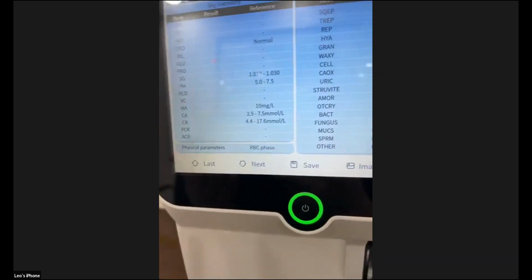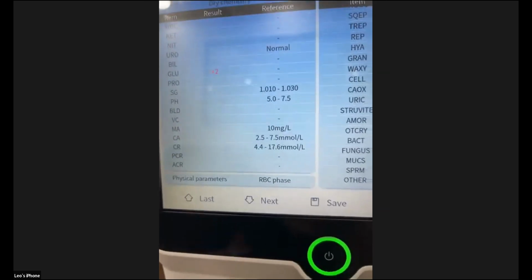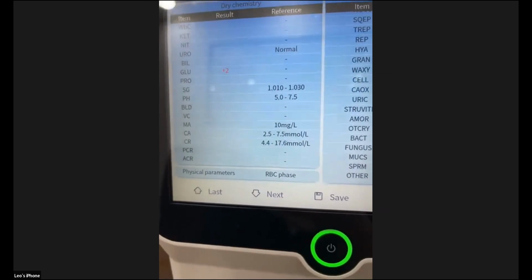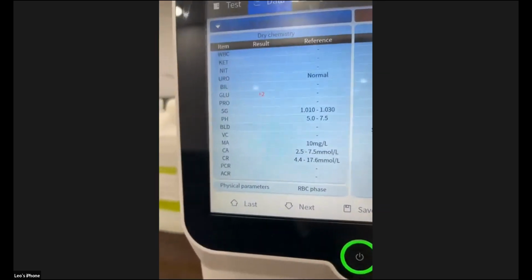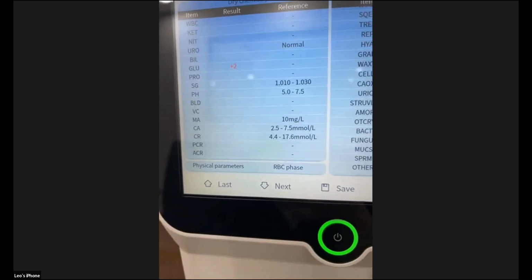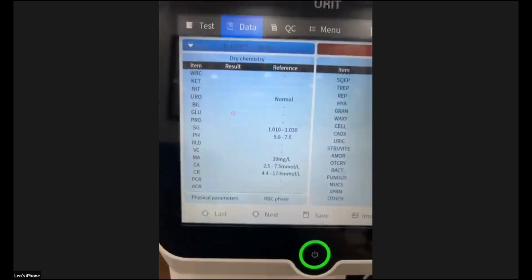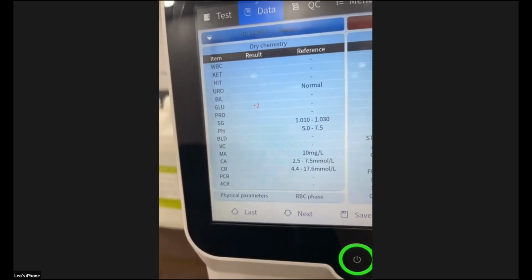So if our dry chemistry gives the accuracy result, the accuracy number, it will not be semi-quantitative. It's fully quantitative. Okay, so is that clear about here? Yeah, it is clear. Okay.